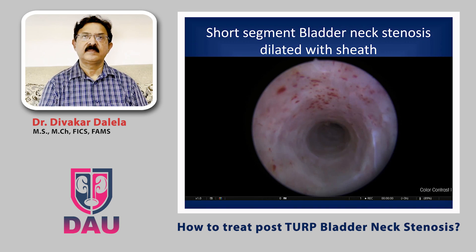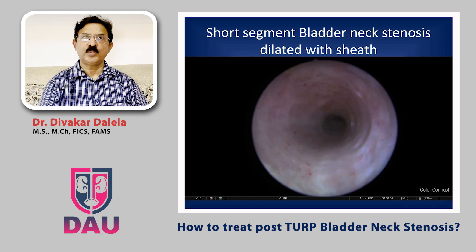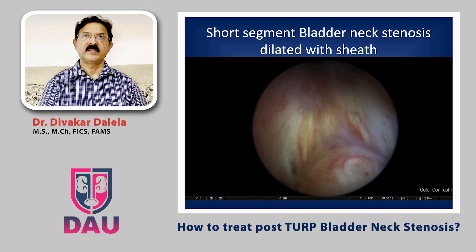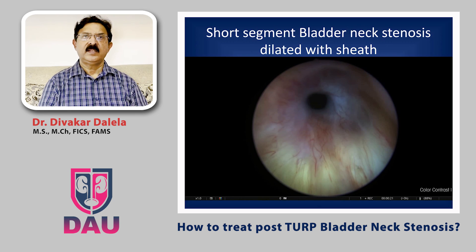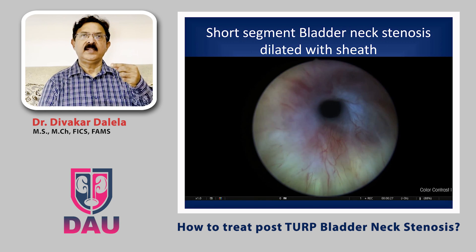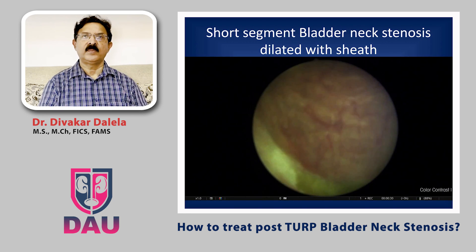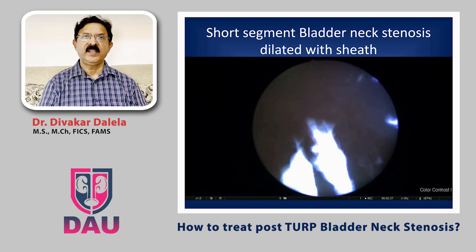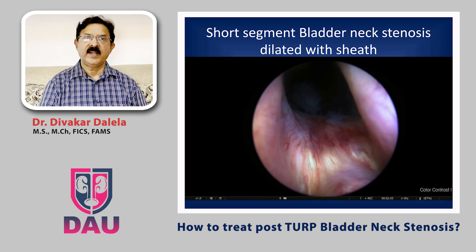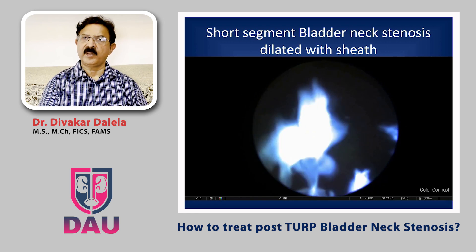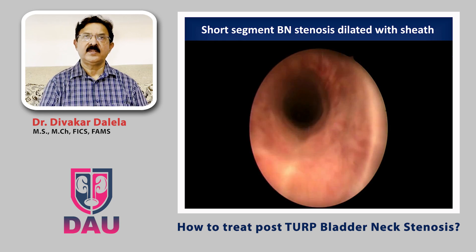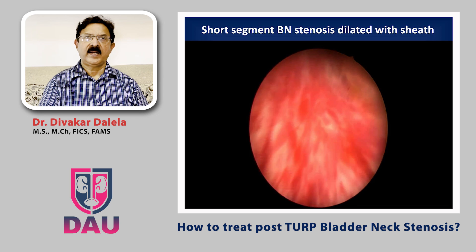This patient has post-TURP bladder outlet obstructive symptoms and as you put your scope inside you will notice a stenosed bladder neck. This is not a very bad case of bladder neck stenosis — it is a thinner septum and as you advance your scope it gets dilated. Look at the thin edges: this is a simple case of bladder neck stenosis with not much fibrotic process. Once dilated, patients do fine.